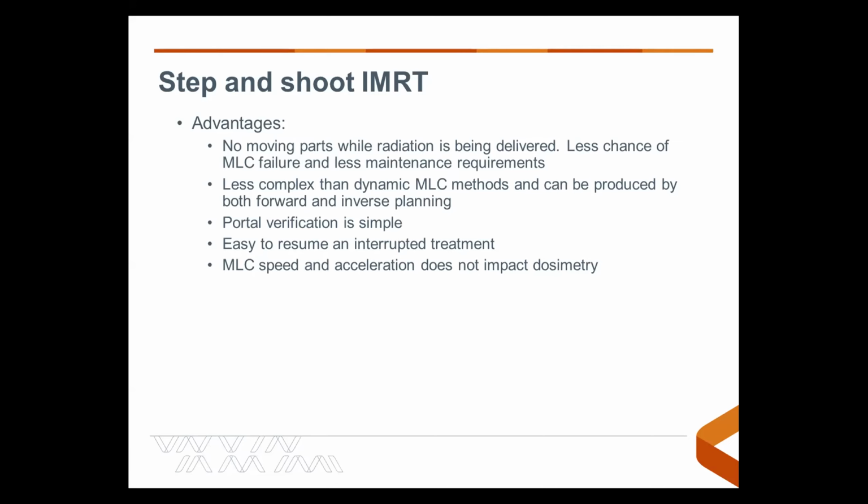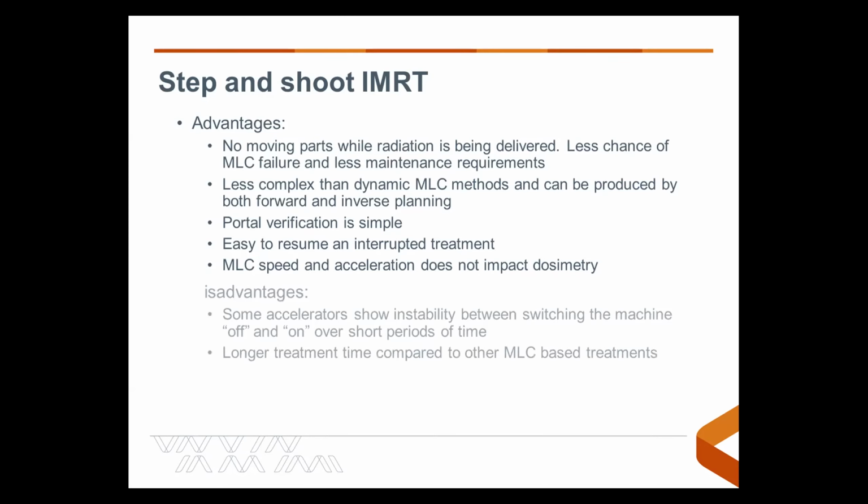Portal verification is simple. It is easy to resume an interrupted treatment because there's no moving parts. It's easy for the MLCs to pick up back where they were last positioned. And because there's no motion of parts during the treatment, the MLC speed and acceleration does not impact the dosimetry of the patient.